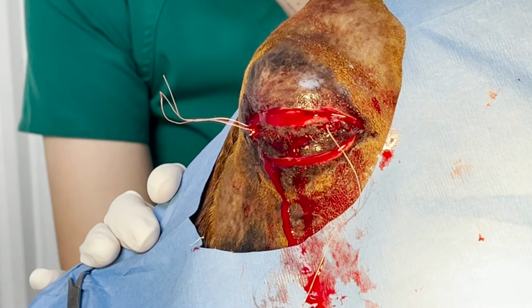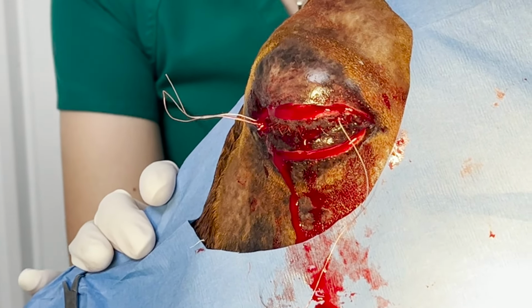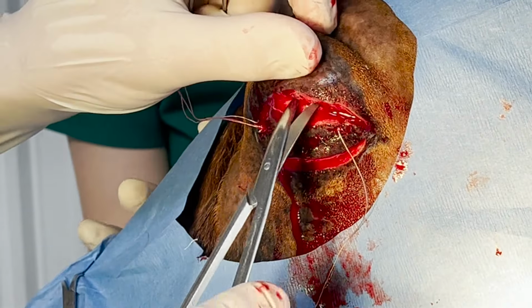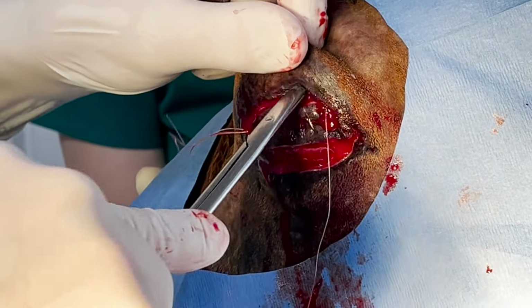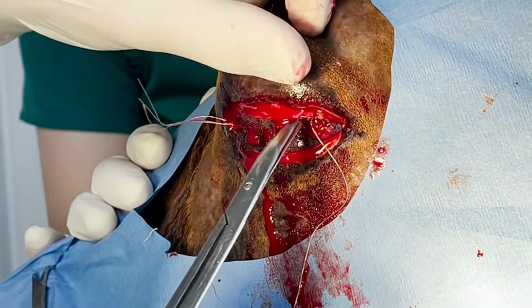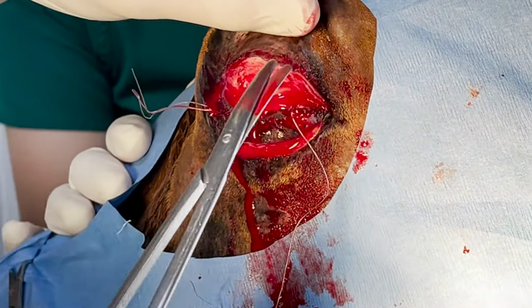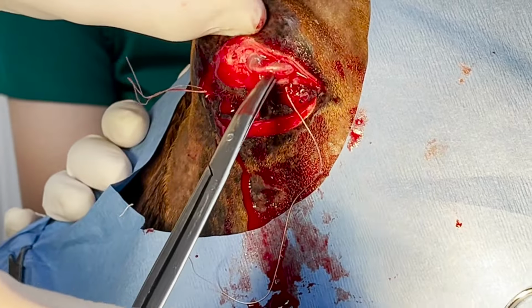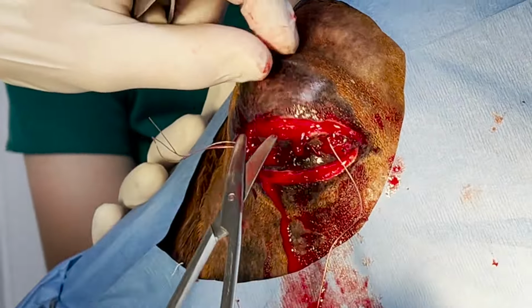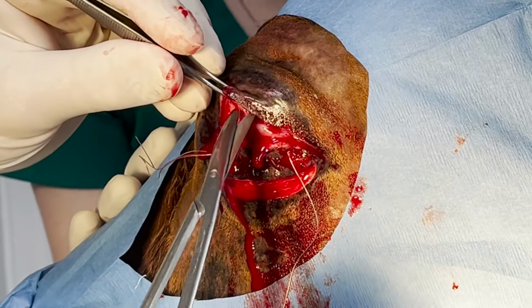And those are the two tails, the suture I left on there. I'll use those as handles a little bit later in the surgery. So now we'll mainly use scissors at this point and do some cutting, and a lot of it's blunt dissection. I'm just going in and spreading the scissors to separate everything as we begin to cut more of the other muscles and tissue back there.